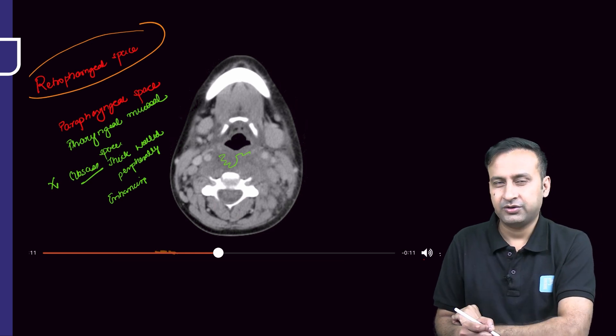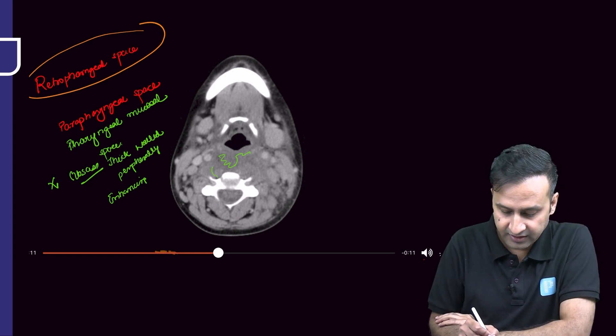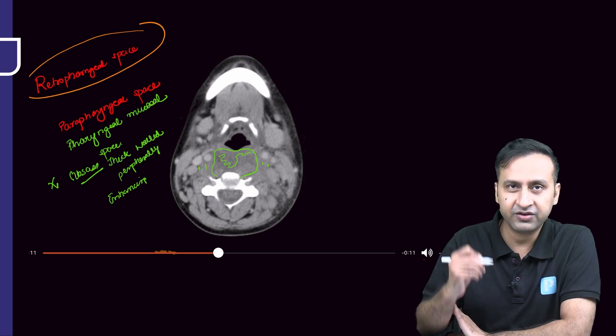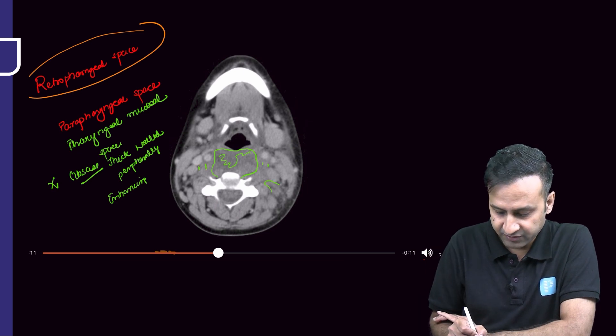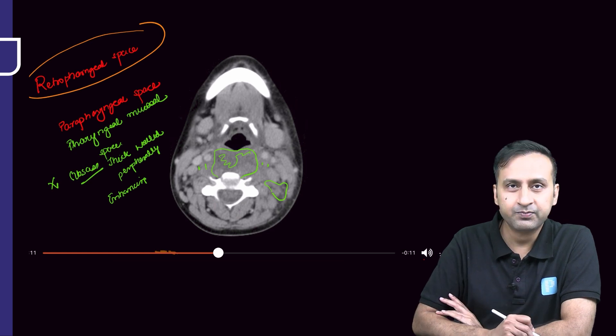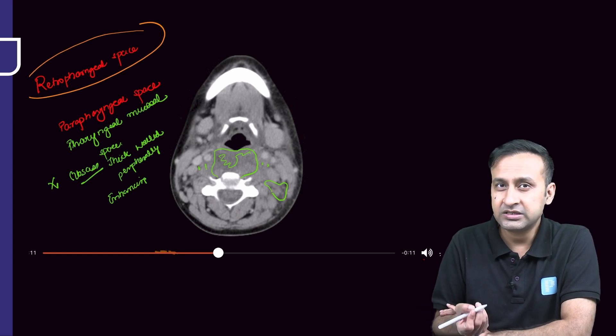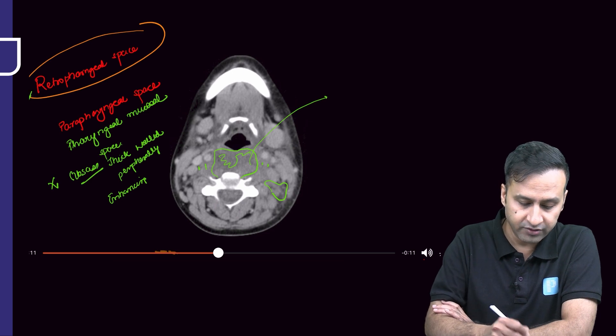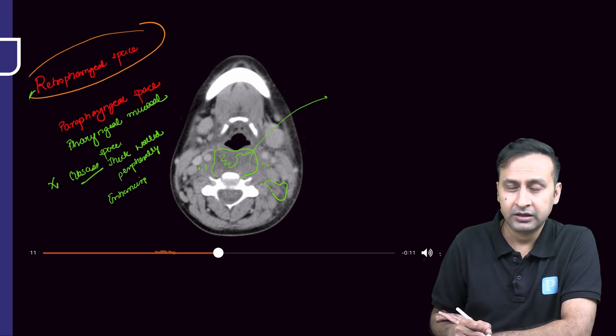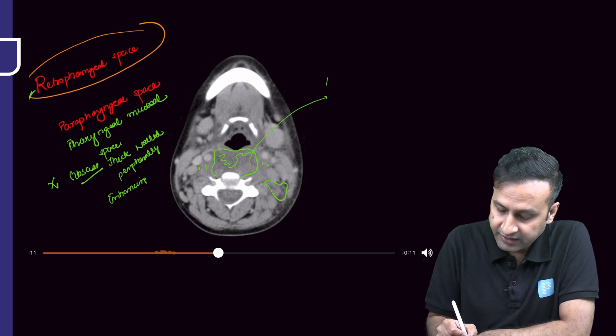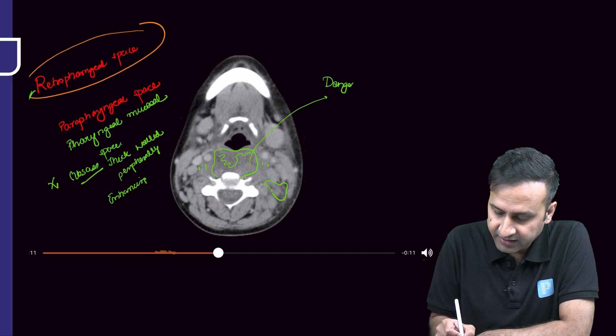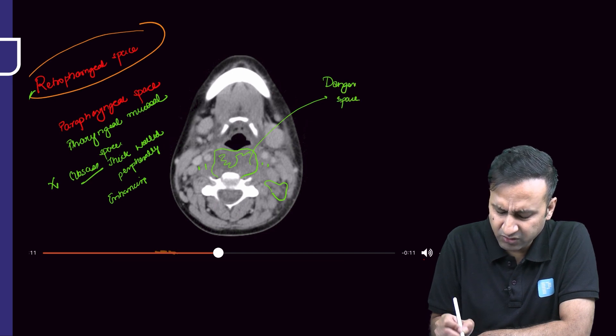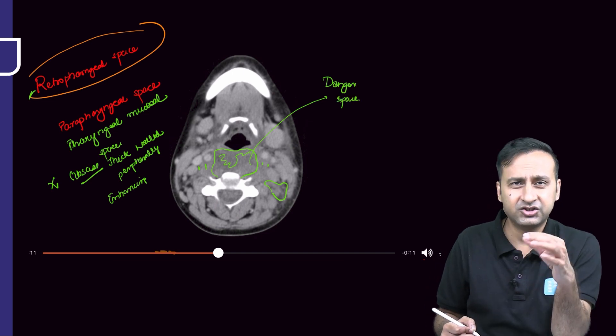A very important question you can ask here: it is lying in the midline here. I can see that the carotid space has been entirely displaced. I can see some inflammatory stranding in this important space. What are the other spaces that are potentially involved here?